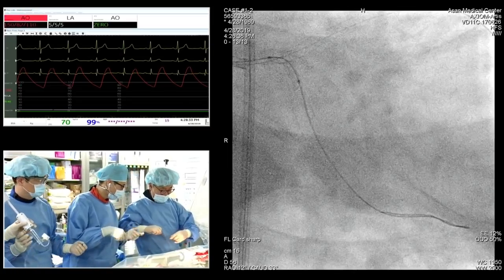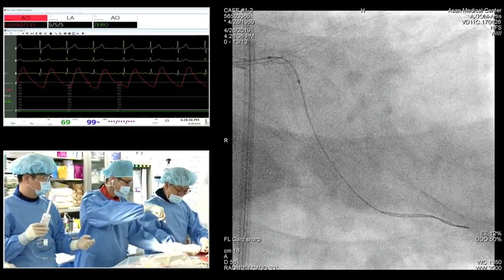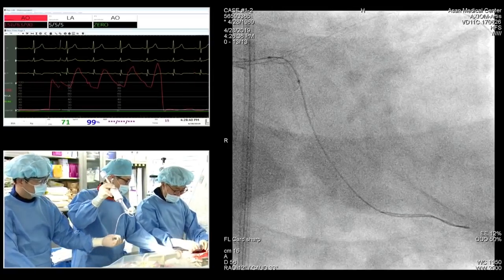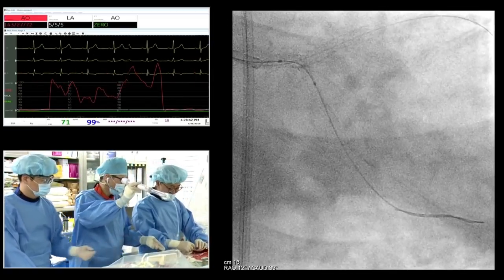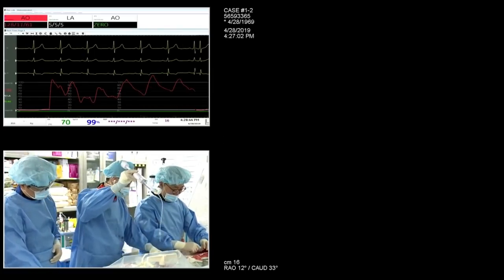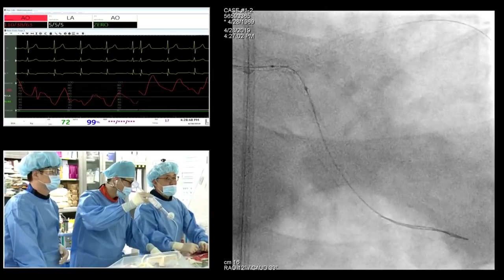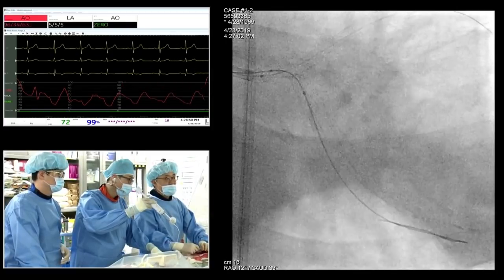Right. In more complex procedures for the main vessel, sometimes we cannot do as we want, and there are two stents. Oh, I see, to provide a very strong support for IVUS, you're going to choose a smaller guiding catheter.